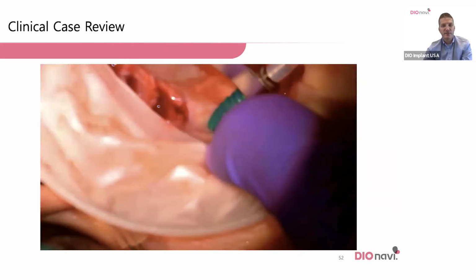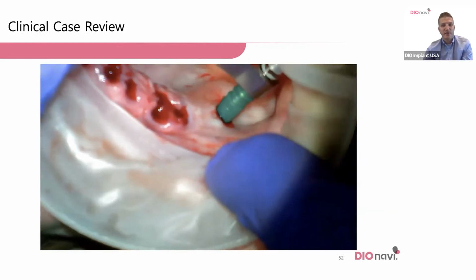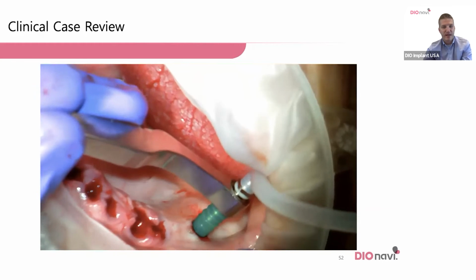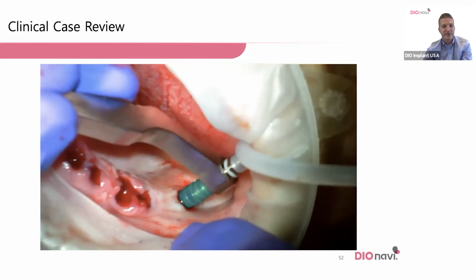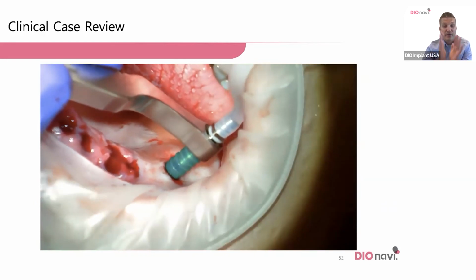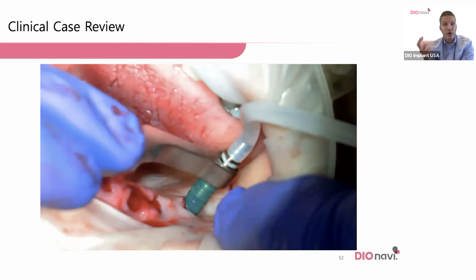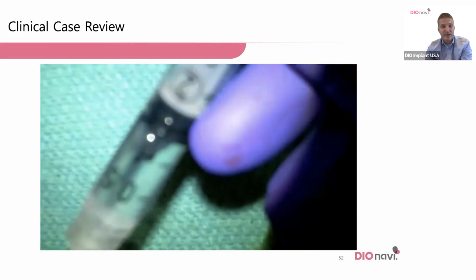I wiggle this around a little bit so you can see you don't want to be too tight with this. Otherwise, it will kind of bend and flex. So just enough where you get a seal, and your assistant can be extremely helpful to make sure you have a good seal, because I believe your eyes should be on the syringe watching what you push. I think that is more important. Just a good steady hold there.